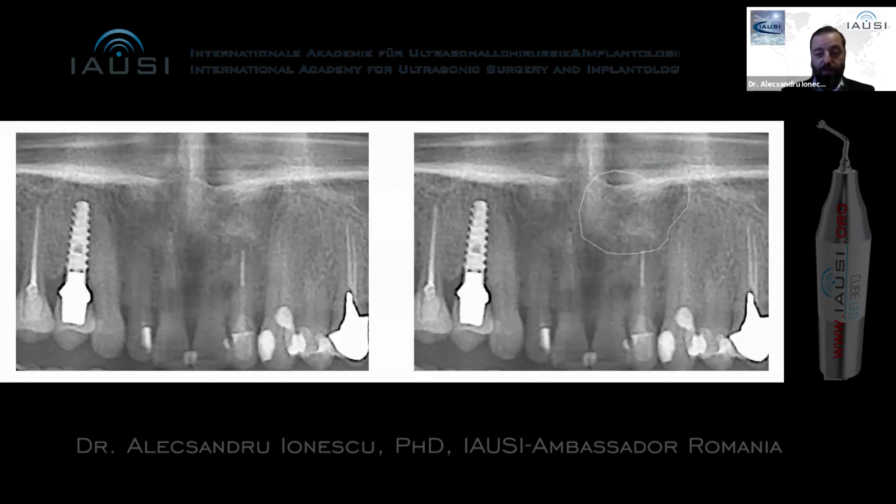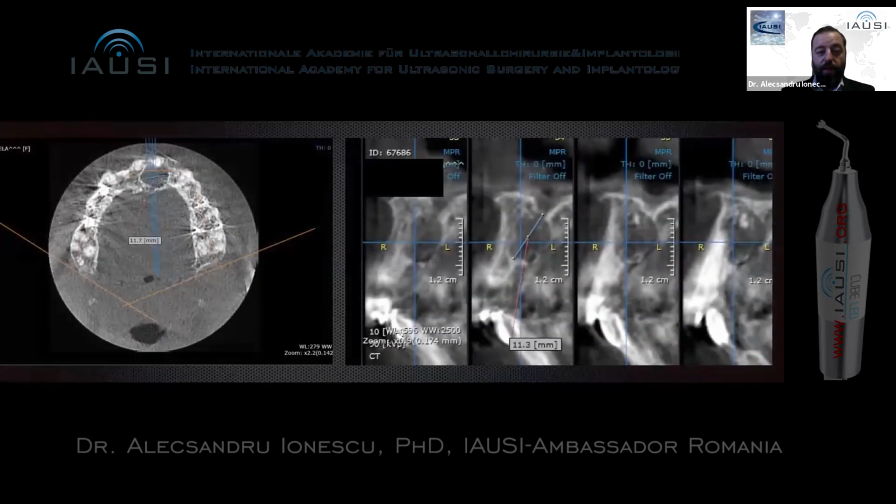It was a tooth that was previously treated with a root canal like 4 years before, and had a small buccal fistula after 4 years. So we made a CBCT scan, and we saw that this patient developed a very, very big cyst, but in a palatal way. So it increased so much until we had the possibility to see the buccal fistula.